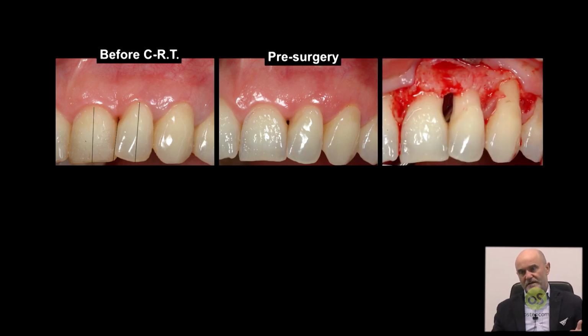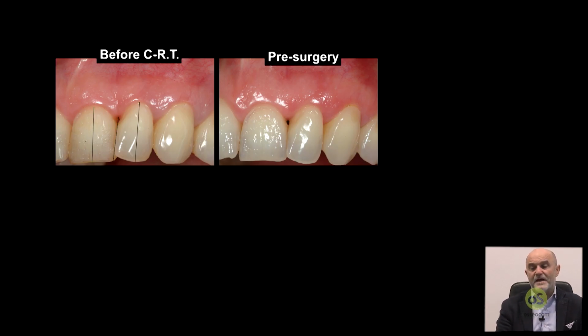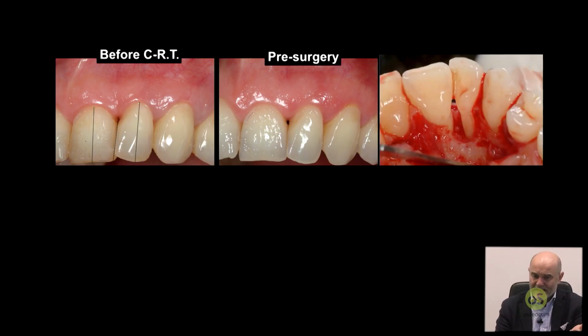Now there is the surgery, which we will see in much more detail later and tomorrow. It's a coronally advanced flap, with the anatomic papilla deepithelialized, and this is done at the buccal aspect and also in the palatal aspect. It's a flap that is done to expose completely the most apical extension of the defect, with, let's say, a very beveled incision at the level of the papilla close to the defect, which are left in place. But again, this is something that we are going to see in the movie.